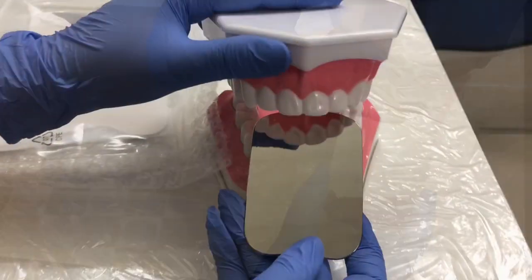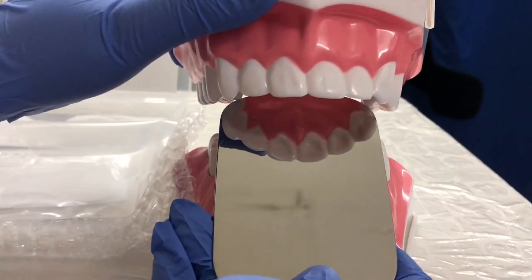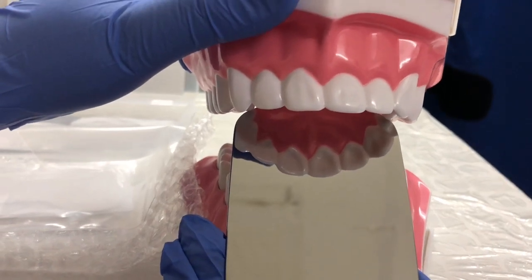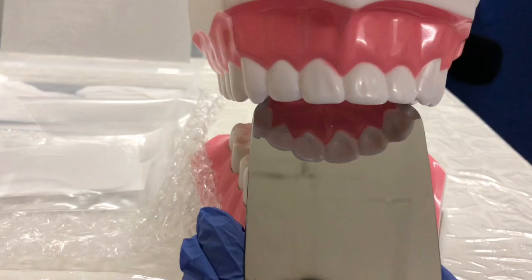Let me show you on the tooth model. You can see it's placed at level and you can clearly see the palatal side.